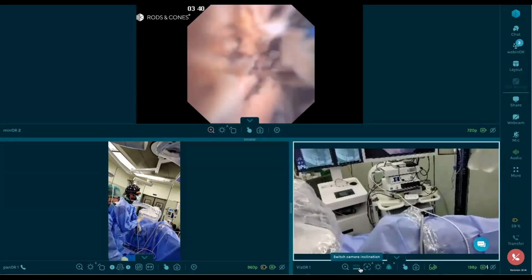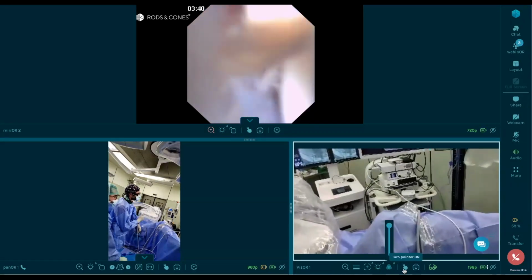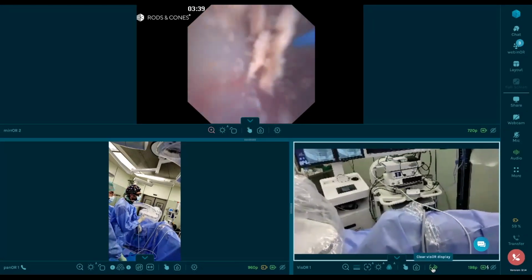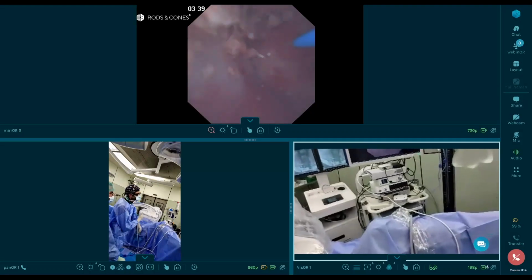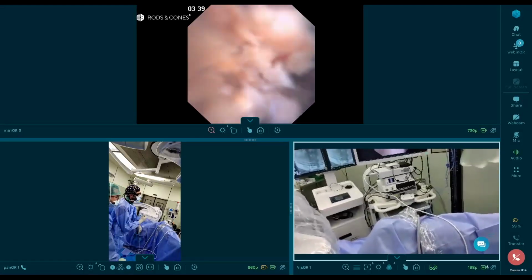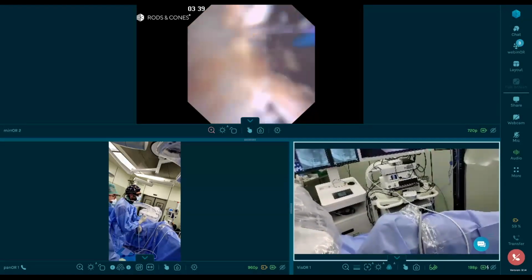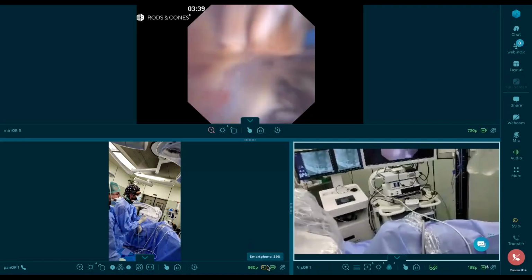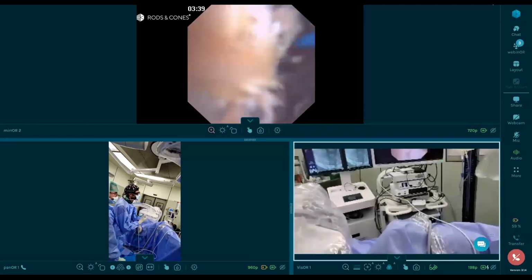So the other good thing that I like here, gracias, Fernando, is to have my laser fiber at 1/3 of the screen. You can see here that it's just 1/3 of the screen, which for me is the best compromise between safety and maneuverability, as we have published. You can see here it is 1/3 of the screen. If you have a lot of fiber on the screen, you may be more prone to touch the mucosa, and if you have less, well, you have more control. So this is, I think, the perfect one. Okay. So we are almost done here.